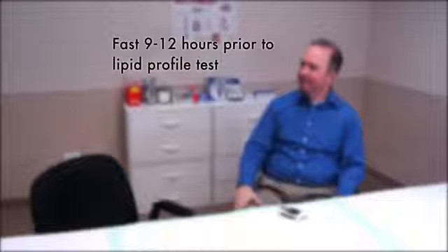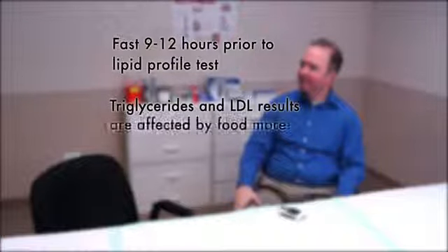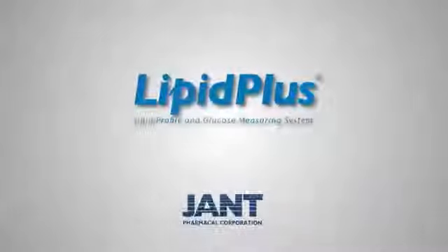The person to be tested should ideally be in a sitting position. The physician or healthcare professional typically advises the patient to fast 9 to 12 hours prior to the lipid profile test. Triglycerides and LDL results are affected by food consumption more than total cholesterol and HDL.